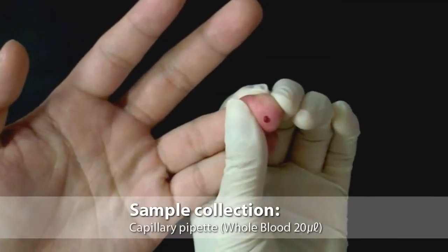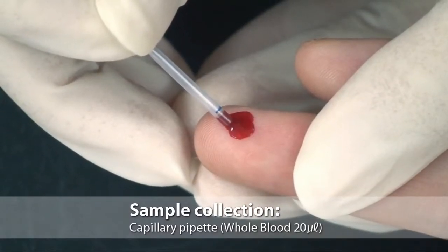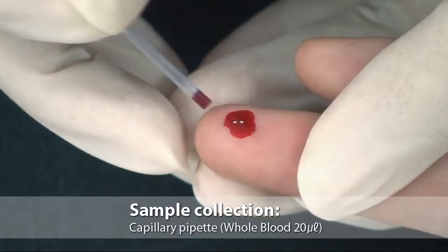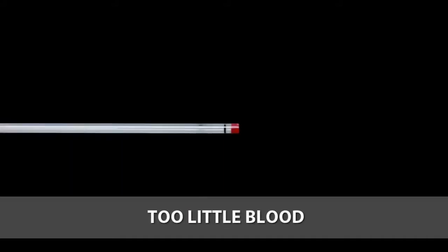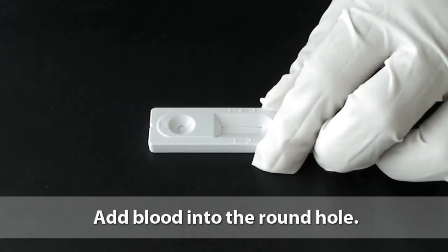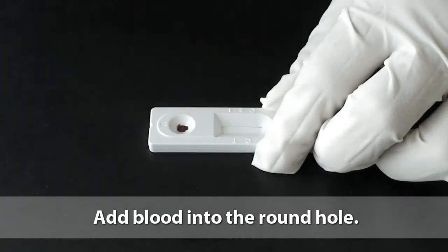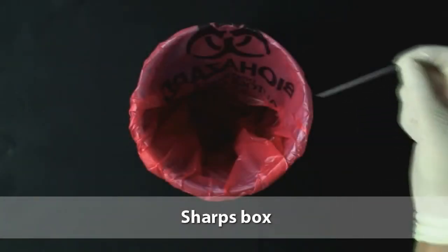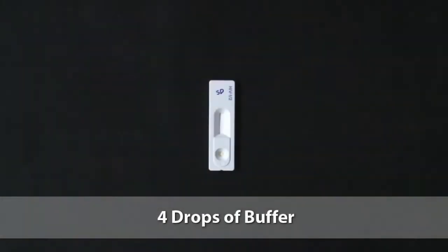As the blood bubbles up, take a disposable capillary pipette and draw the blood into the capillary pipette to the black line. The amount of blood collection is critical. This is the correct amount of blood. It is too little. It is too much. Add 20 microliters of drawn blood into the round sample well. Discard the capillary pipette immediately in the sharps box.